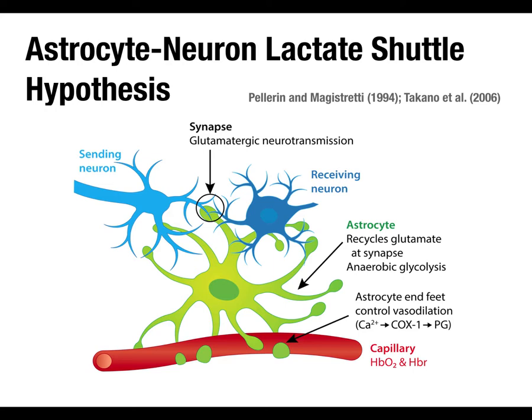So it's more like it's sensitive to the postsynaptic potential changes at the synapses than necessarily what the neurons do with that information, which is not unlike EEG, where it's really all about the postsynaptic potentials, right? So it matters in both. The big difference is that with fMRI, we have very high spatial resolution. So we see changes locally in a particular brain area, and we say, oh, there's changes there. But that's really primarily reflecting changes in the information coming into that brain area, rather than what it's sending out.